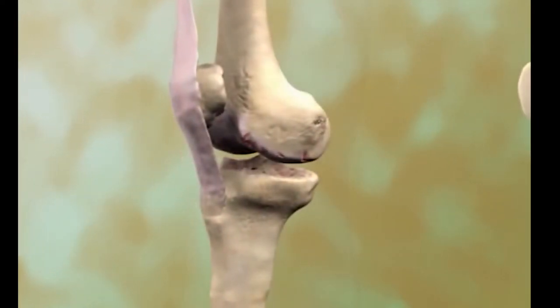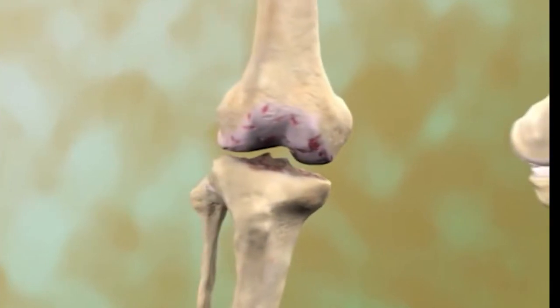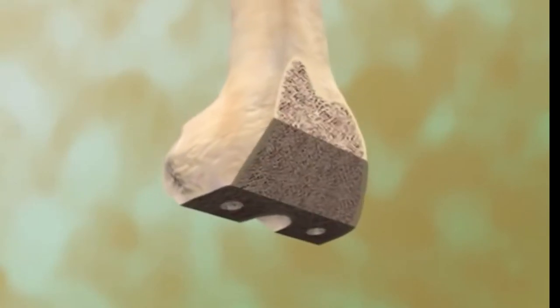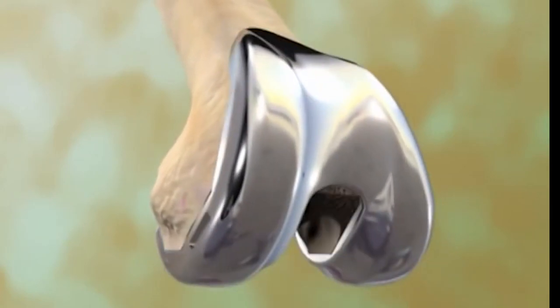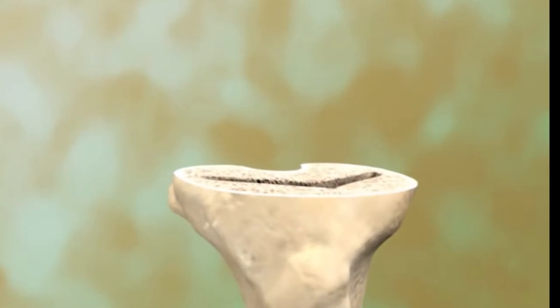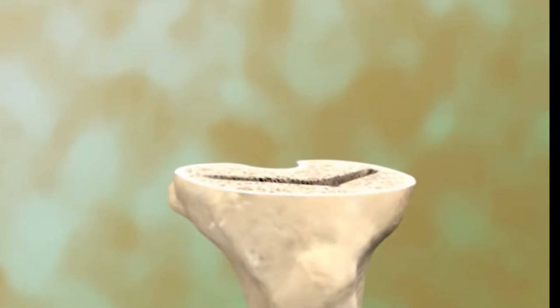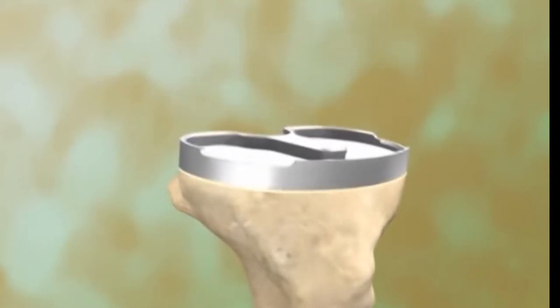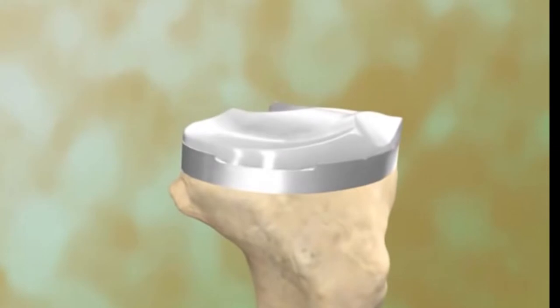The procedure begins with an incision on the front of the knee, and the kneecap is moved to the side. Damaged bone and cartilage at the end of the femur are cut away, and the bone is measured and cut to fit into the femoral component, which is then attached. Next, damaged bone and cartilage at the top of the tibia are cut away, and the bone is measured and cut to fit into the tibial component. A metal tray is fit against the flat cut top of the bone, with its stem inserted into the bone. A plastic insert is snapped into the tibial tray.